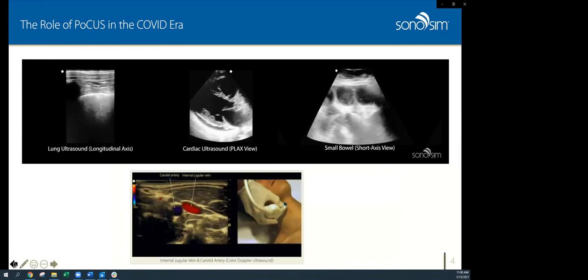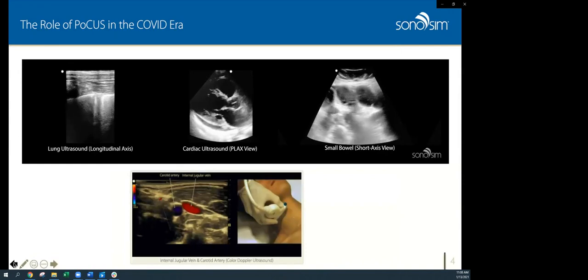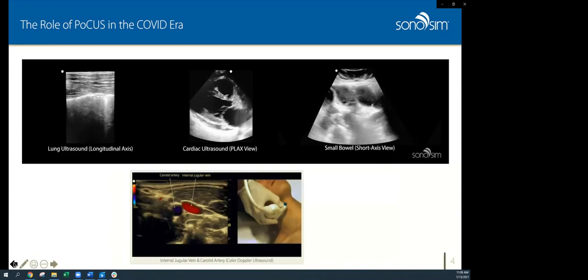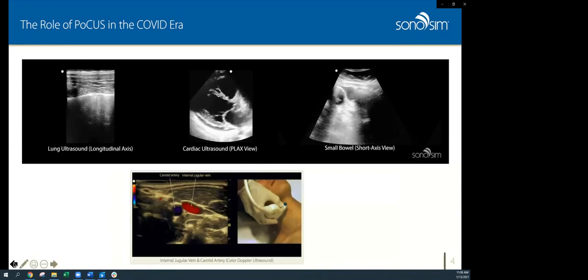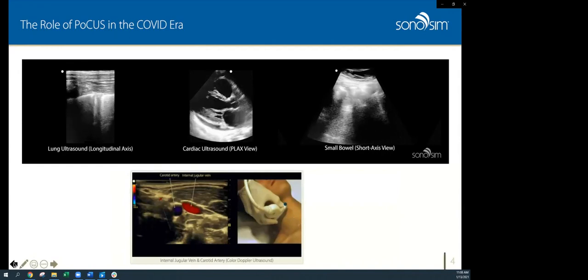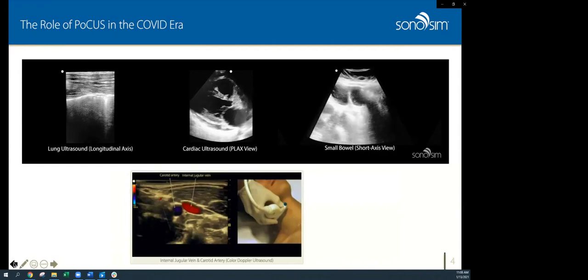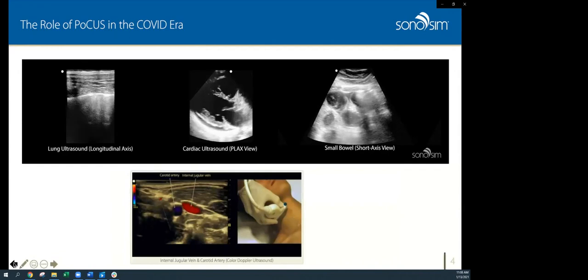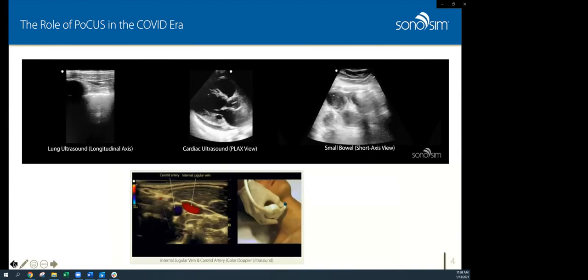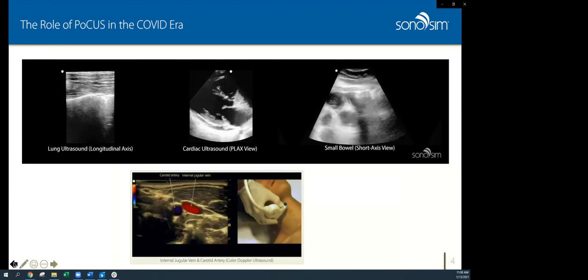So when you have someone who comes in with dyspnea, your classic COVID patient, they're hypoxemic, but they're not air hungry. Many times you're trying to decide, is this a patient that gets monoclonal antibody and can be sent home, or do they need dexamethasone and be hospitalized? So you're looking at their oxygen saturations. You're trying to see very quickly, and many times with limited resources, what's going on in the patient's lungs. There are characteristic findings on lung ultrasound that are consistent with COVID infection, which you see in the upper left, where you get focal subpleural consolidations or B lines. Those findings are highly suggestive of COVID infection. And then depending on the distribution of those findings, you can infer the severity in concert with looking at the patient and the patient's pulse oximeter readings.